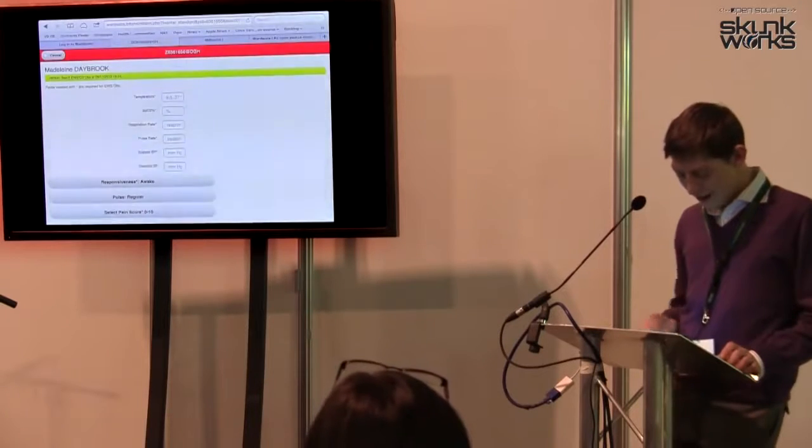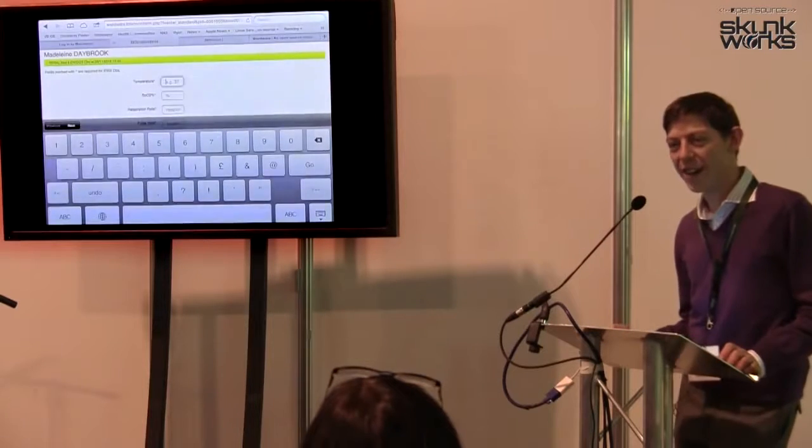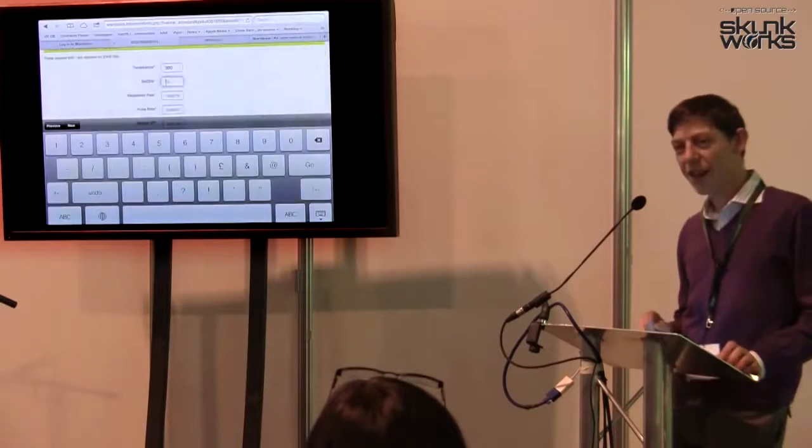Let's do some EWS obs for a sick patient. Blood oxygenation.